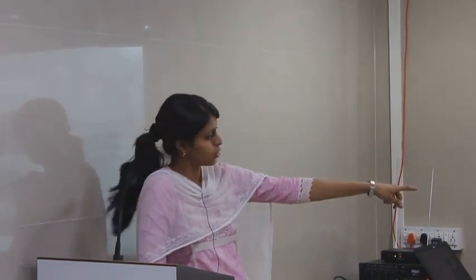So you see there, so many teeth are heavily restored. They have given an arrow mark, because when the dark area is meeting another lighter area, you have an illusion as though there is a dental caries there, but it is not a dental caries. It is an optical illusion.